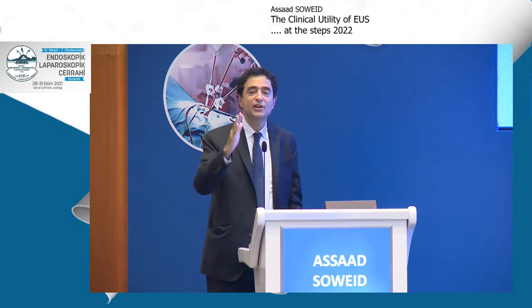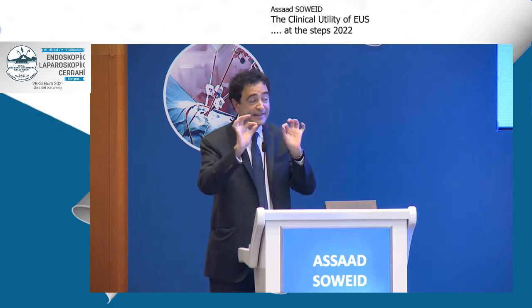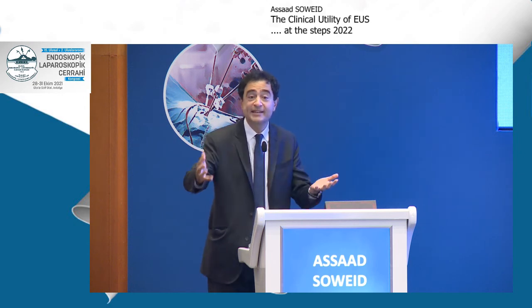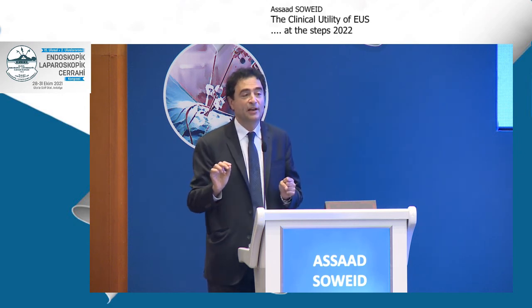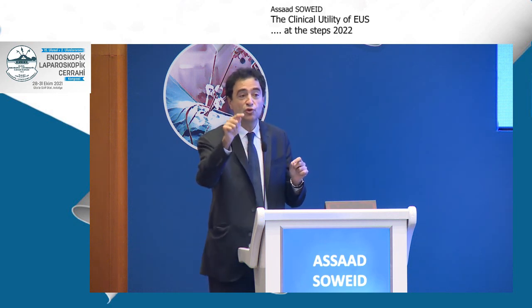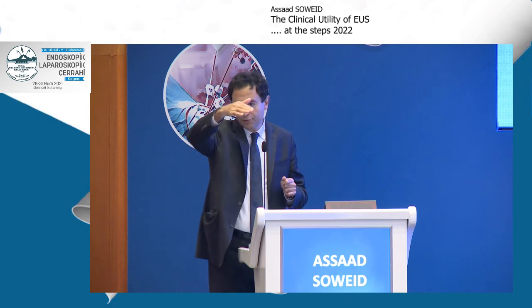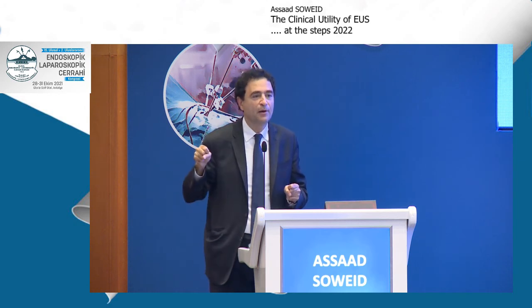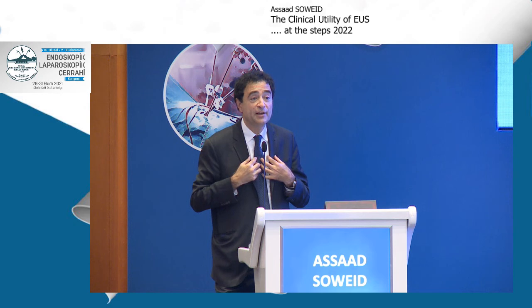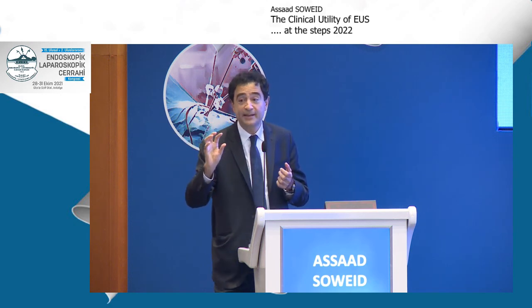Well, the initial data is like, why is EUS safer seeding-wise compared to a CT-guided biopsy? Well, we know it's safer, but there are many reasons for that. Number one, if you're getting an FNA in the head of the pancreas or neck, it's easy because there is not much distance outside, and if you do a Whipple, it will be a part of the Whipple sample. But the data came from our Japanese colleagues that looked at lesions in the body and tail, especially cystic lesions.